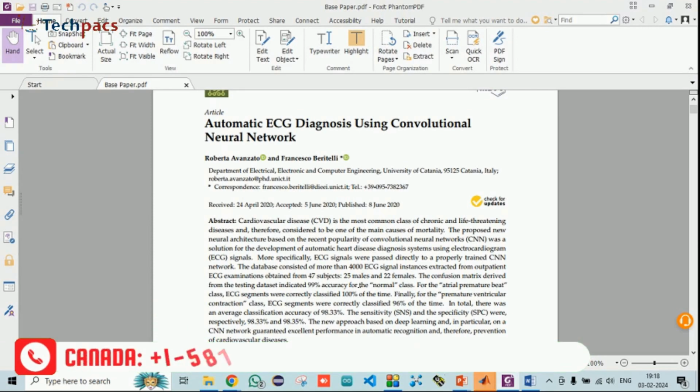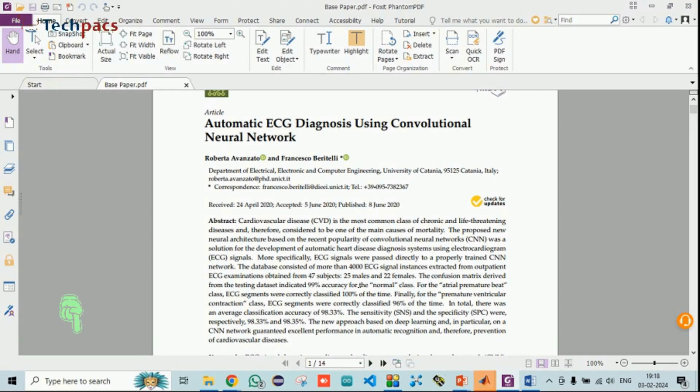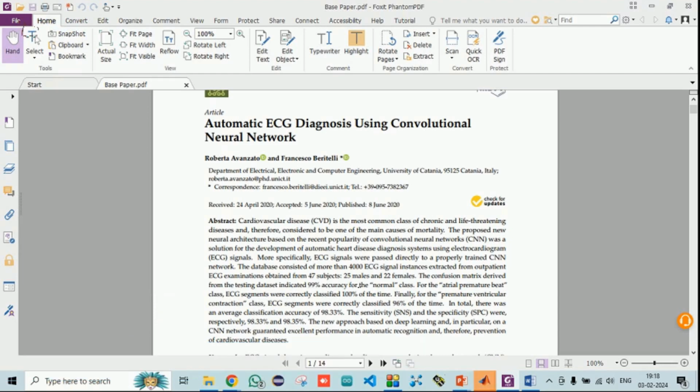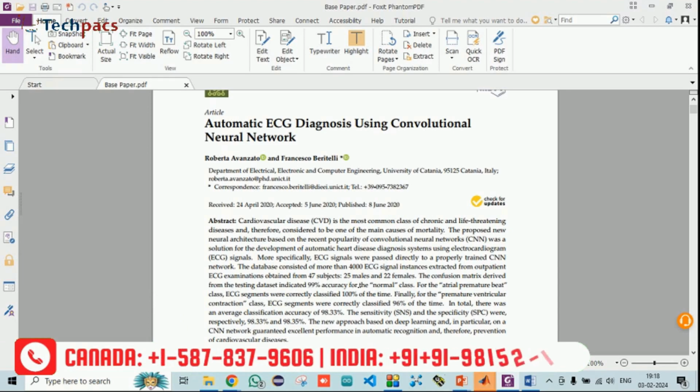So the crucial issue with this particular model was that they were using a CNN model, which is specifically designed for image-related data, not for signals. Secondly, they are passing the signal directly instead of working with the information underneath it, because deep learning is only effective when you have refined, precise data where the information cannot be easily extracted. But the literature shows that in such domains machine learning is very beneficial.